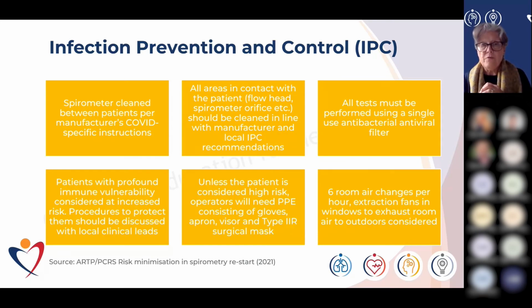All tests must be performed using a single-use antibacterial, antiviral filter. Now, I have been contacted because some nurses are saying that they don't need to use those anymore. That's certainly not the information that I've got. We should still be using antibacterial, antiviral filters, and they are different to the antibacterial filters that we were using pre-COVID.